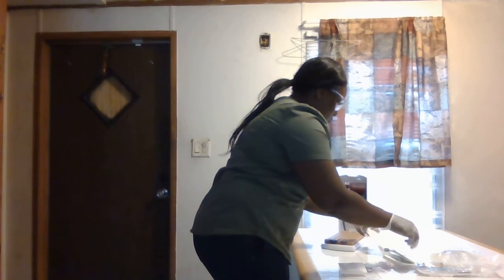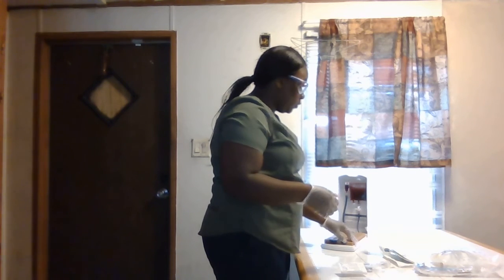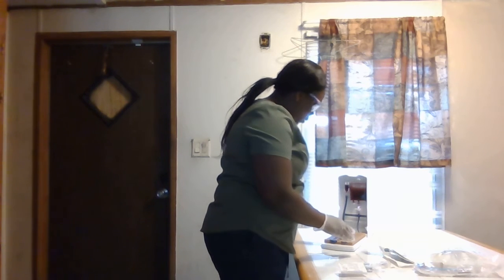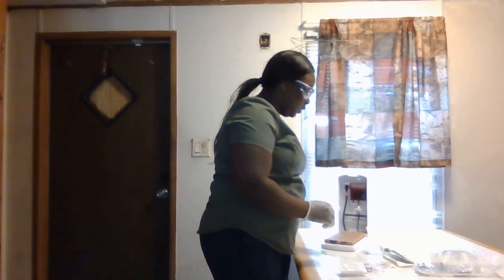And I just want to kind of separate them, just like I saw Ms. Murphy do. Kind of separate so it'll be easier for me to get to. Okay, so I'm going to apply my tourniquet. Once we apply the tourniquet, we always check for a pulse. Okay, so I have my pulse. I'll choose the vein. I'm going to use this one. So once I found my vein, I can go ahead and pop my tourniquet.